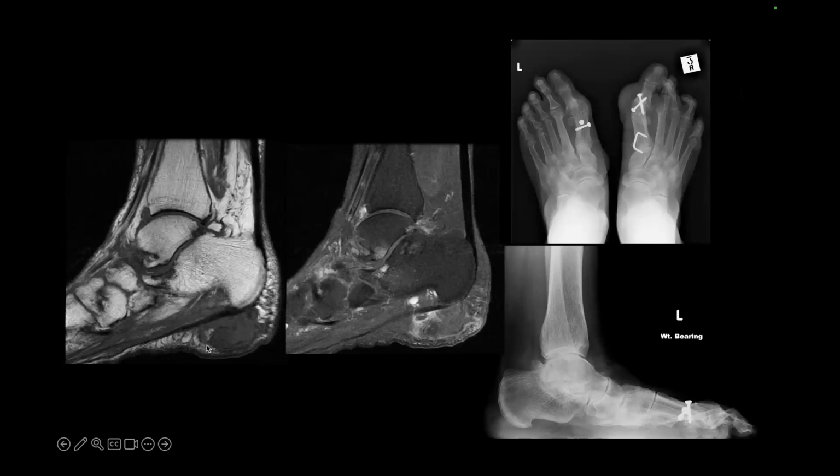And another case of rheumatoid arthritis, again affecting the feet, multiple erosions in a proximal distribution, and with inflammation, bone marrow edema, and here's a large rheumatoid nodule at the plantar aspect of the foot.